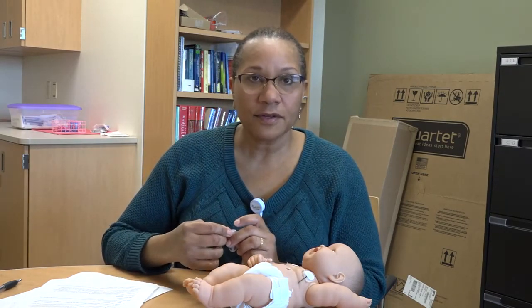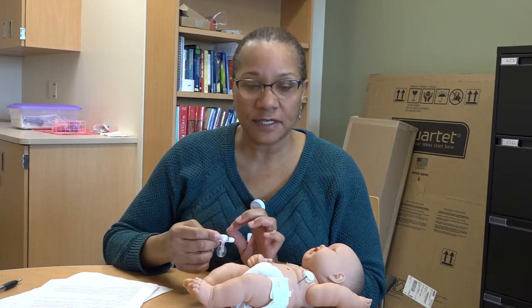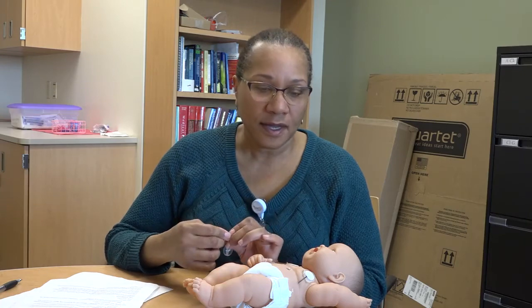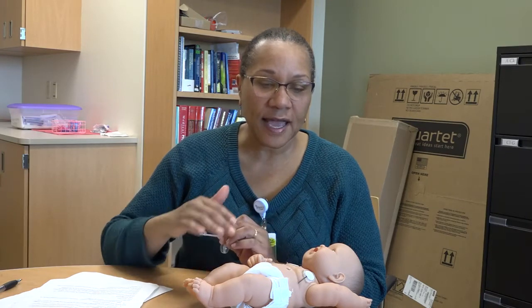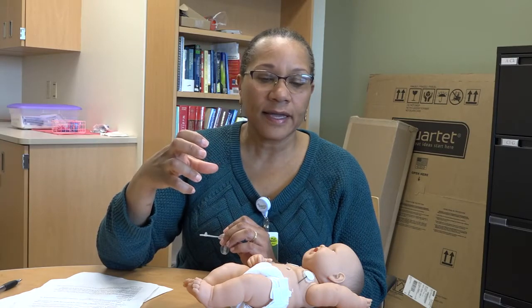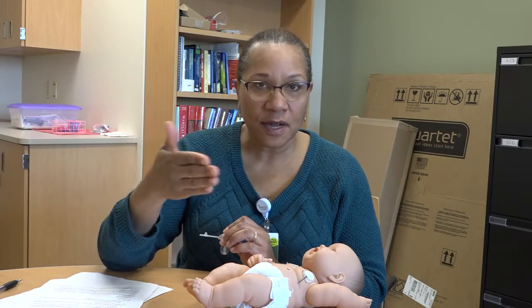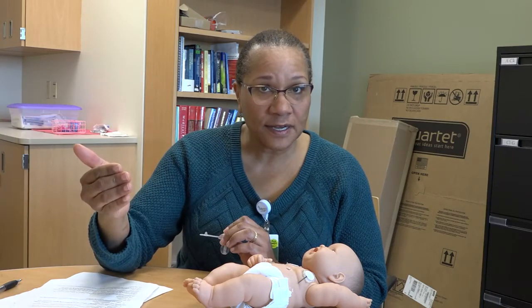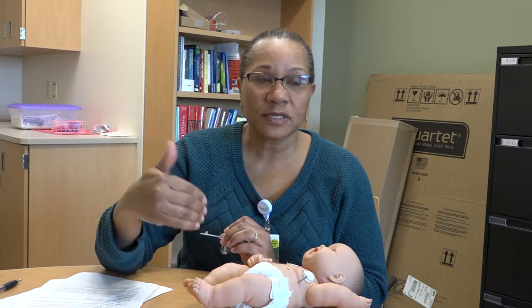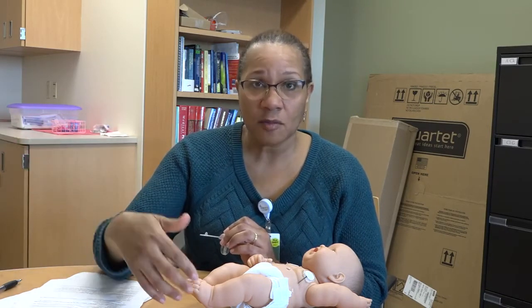Now we're going to talk about decompression or venting. Another term for that is also called burping. And what you're going to do is, after the baby has had their feeding, then you wait about 20 to 30 minutes and see what their comfort level is. Sometimes they might get a little fussy. You may learn that your baby needs to be vented immediately after their feeding. You're going to do what's comfortable for the baby. But what we're trying to do is let excess gas escape, air bubbles escape.